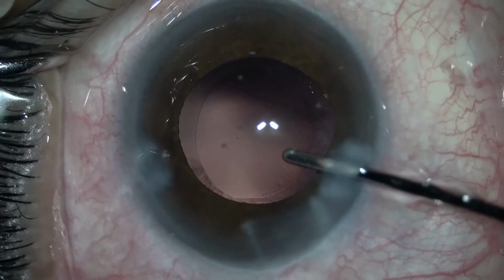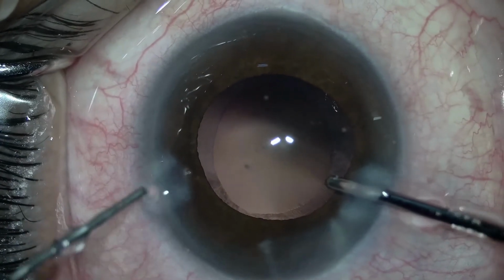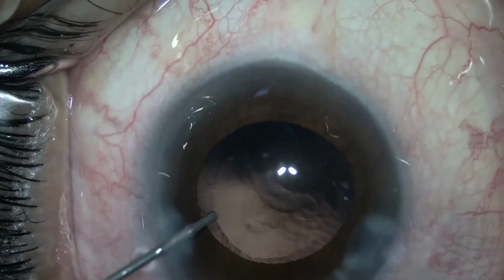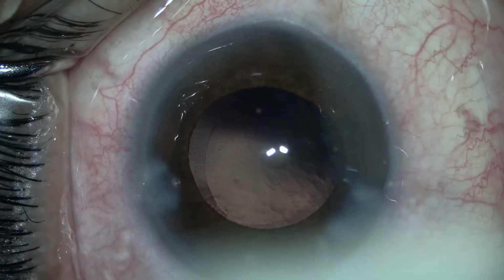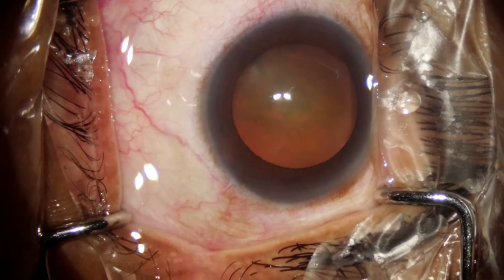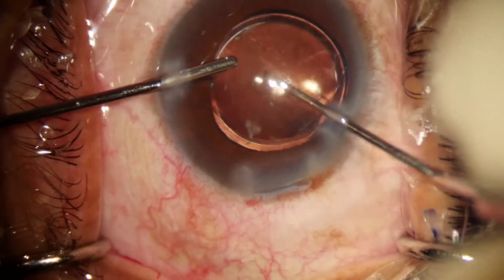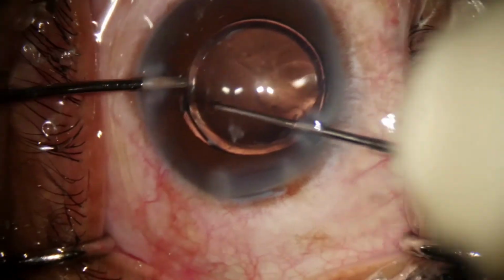Capsular bag distension syndrome has seen an increase in incidence due to the reduced diameter of capsular rhexis. With various anterior capsulotomy innovations and increased awareness regarding the need for uniform capsular overlap, anterior capsulotomy with reduced diameter has become the new norm. Moreover, in pseudo-exfoliation syndrome, a three-piece IOL is implanted in the sulcus with optic capture by the anterior capsular rim. These two situations, particularly with retained OVD, are associated with increased risk of capsular distension.